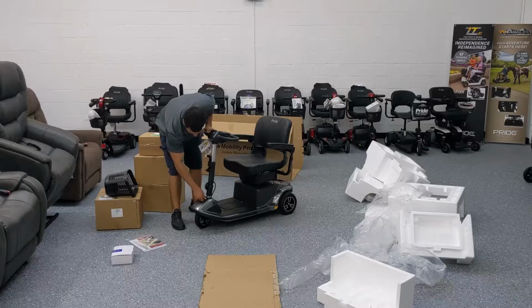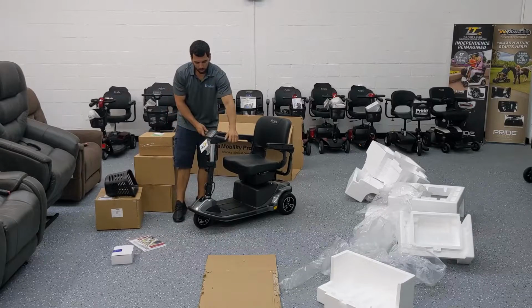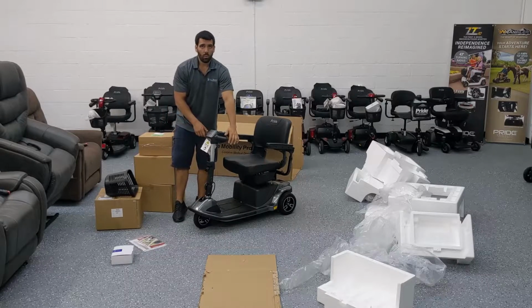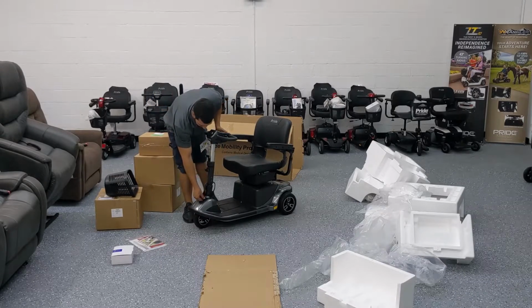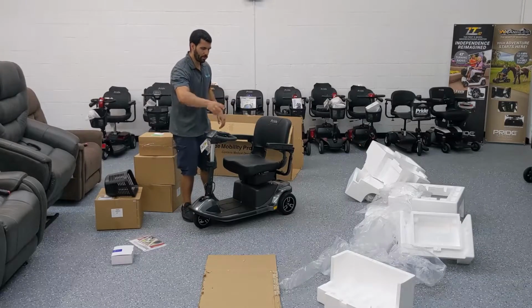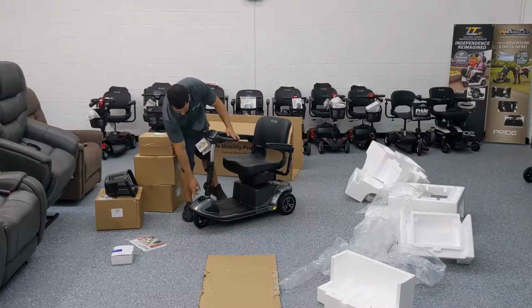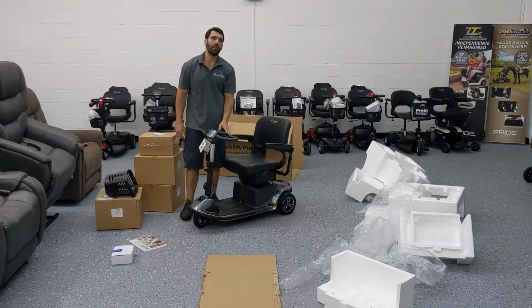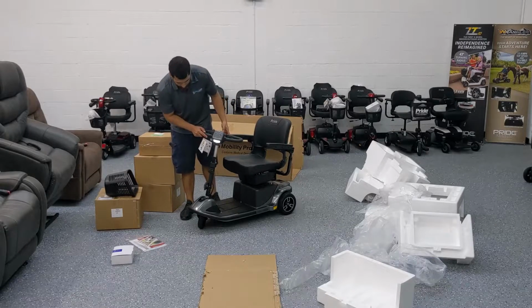And then last but not least, on the front here, you've got a little button which is spring-loaded. Push it in and turn it clockwise, and it's going to lock you, and you won't be able to turn. When you're transporting a scooter in the back of a vehicle, you want to have that lock engaged so that the steering wheel doesn't go crazy and swing from left to right. So if you're not able to turn your scooter, it's more than likely just that spring-loaded switch. Give it a shot, and it should work fine.